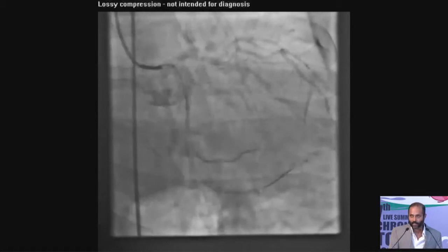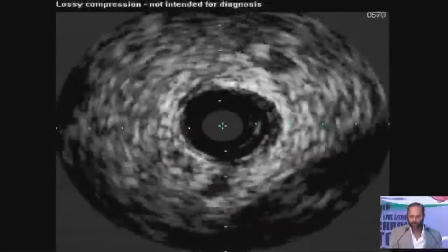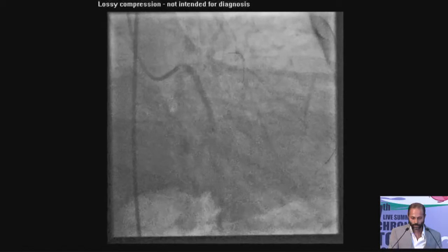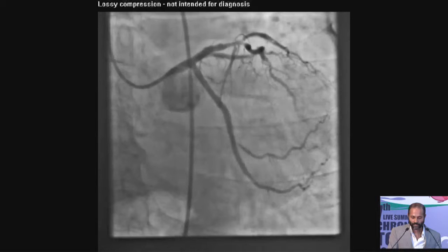So easily wired both. Balloon. There's an IVUS which essentially shows that distally was true, limited subintimal. So I'm going to skip it in the interest of time. Balloon, balloon, stent. See, the other branch is not doing so well, but you have a wire. That's the final result.